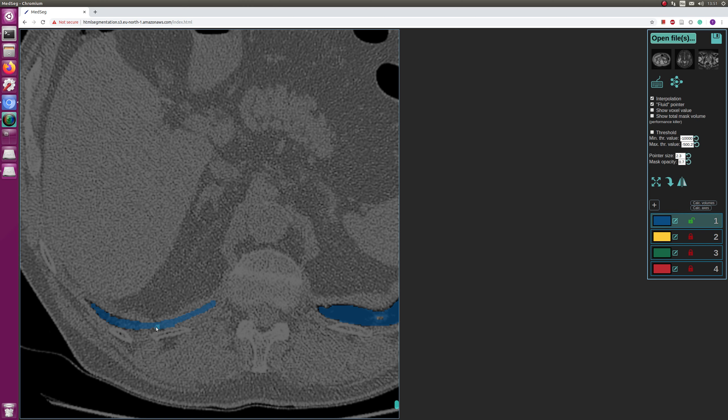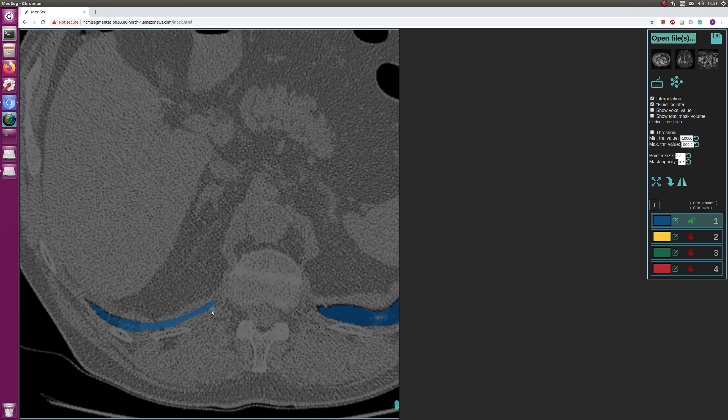And the F key hides and shows the segmentation. You can also change the opacity of the segmentation with M and D buttons, or you know, you can just write it here, whatever level that you want to have.